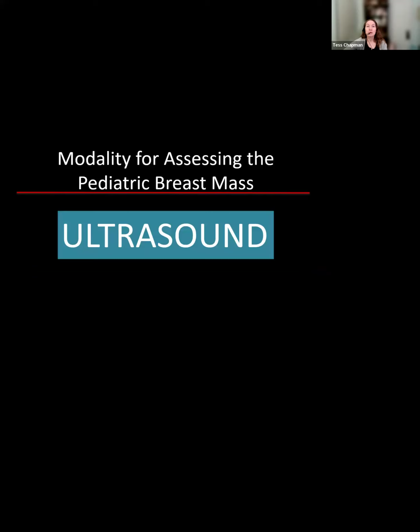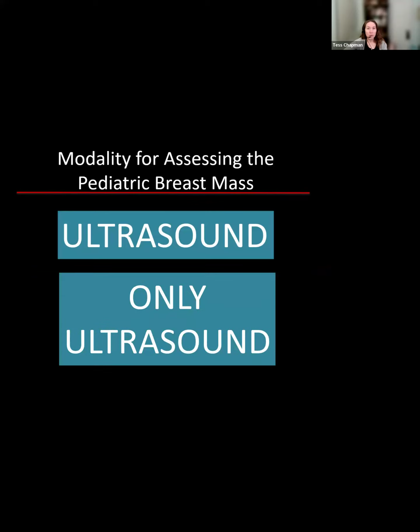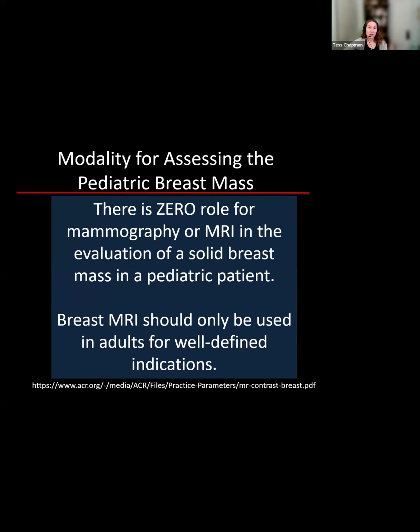As far as the modality for assessing the pediatric breast and a palpable mass, ultrasound is the modality, only ultrasound. I want to emphasize that there is no role at all for mammography or MRI in evaluation of a solid breast mass in a pediatric patient. Breast MRI should only be used in adults for very well indicated situations.